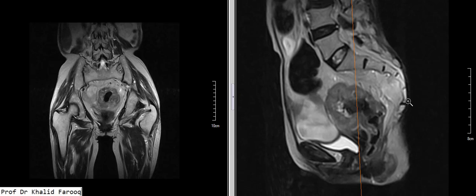So we can use these modalities for the assessment of carcinoma of the rectum, and we have to comment about size of the lesion, its perirectal extent, involvement of adjacent viscera, abnormal lymph nodes, ascites, and metastatic foci in adjacent surrounding bony pelvis. Similarly, assessment of the chest and abdomen is also important to rule out metastatic foci in these areas with the help of CT scan. Thank you so much.